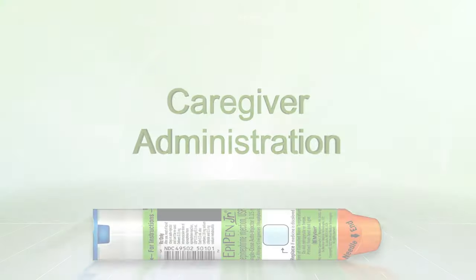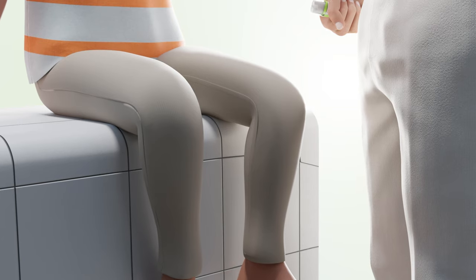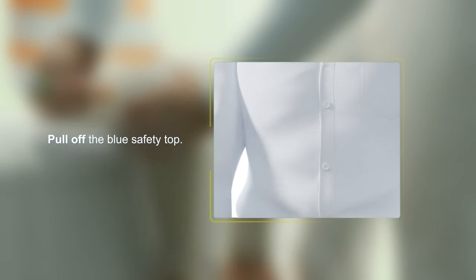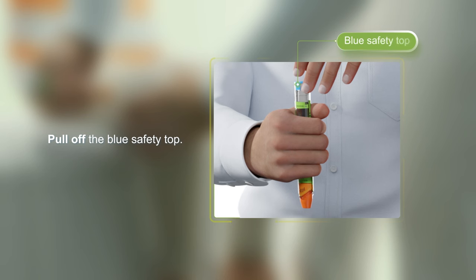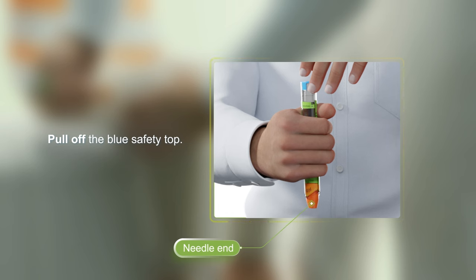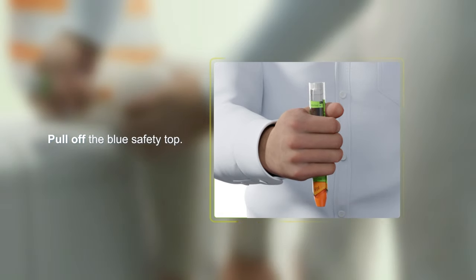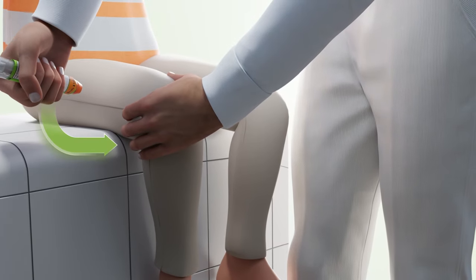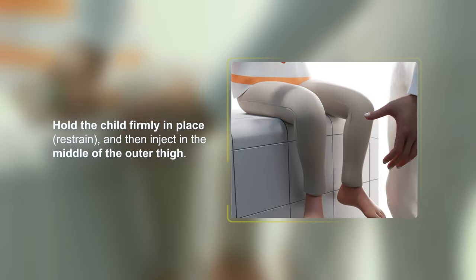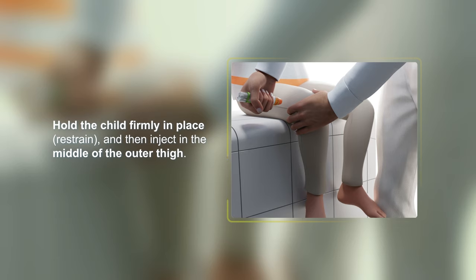Caregiver Administration. If you are giving EpiPen or EpiPen Jr. to a young child, first hold the child firmly in place, then use both hands to remove the blue safety top. Use one hand to hold the auto-injector with the orange needle end pointing down and the other hand to remove the blue safety top to activate it. Then inject in the middle of the outer thigh. Hold the leg firmly in place before and during the three-second injection to avoid needle stick injuries, including cuts to the thigh.